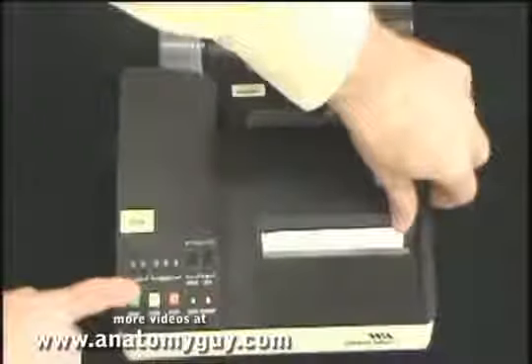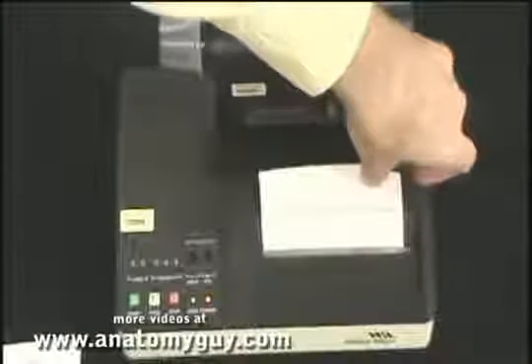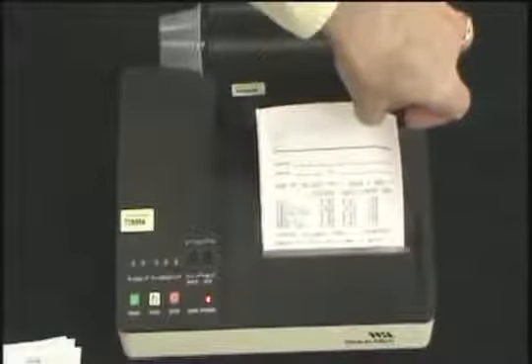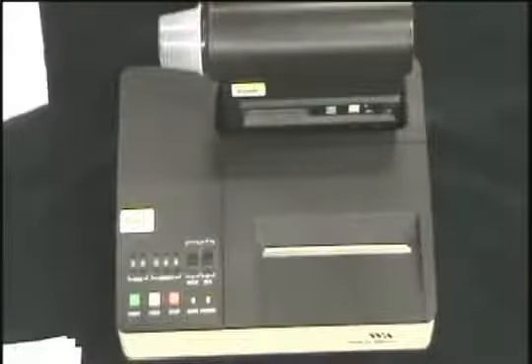We've put the spirometer in the machine, and we are about to print out Dr. Goodmurphy's results. Looks pretty good, Dr. Goodmurphy.